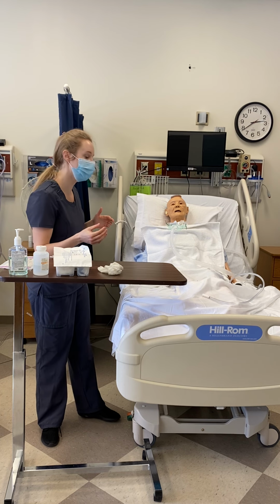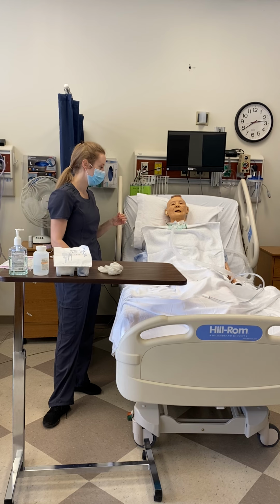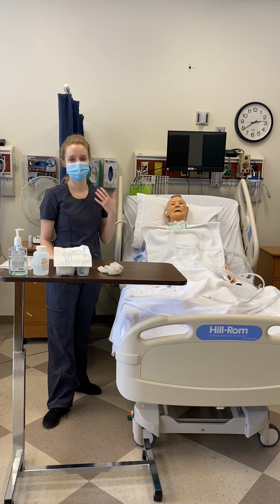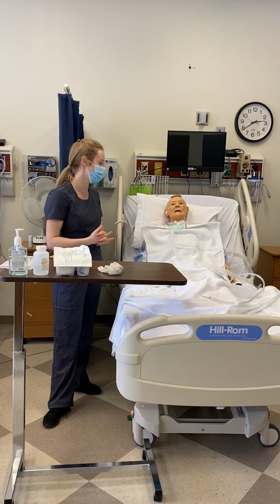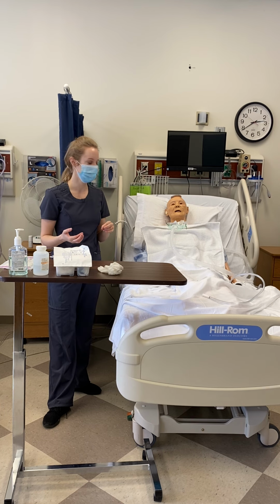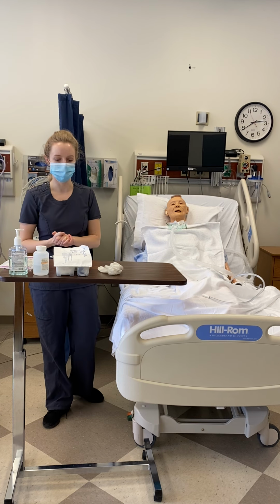First of all, hopefully while I'm suctioning his trach, I've looked at the area. I want to know if it's bleeding, if there's secretions, if there's any swelling around the area, what the dressing looks like, and make sure that I document all of that. I also want to make sure he is hyperoxygenated prior to this as well.